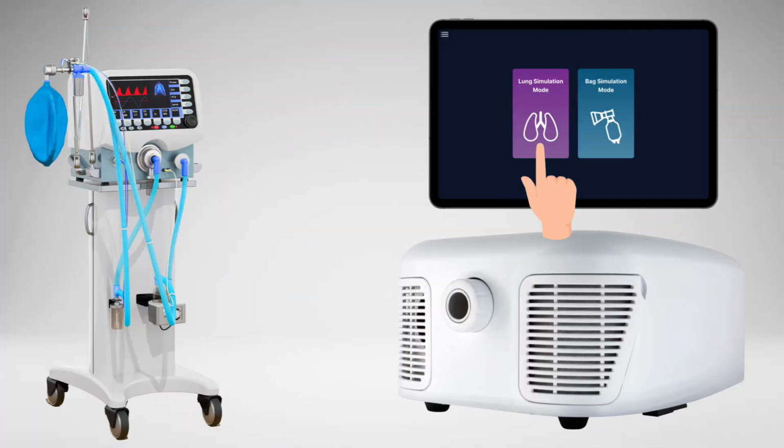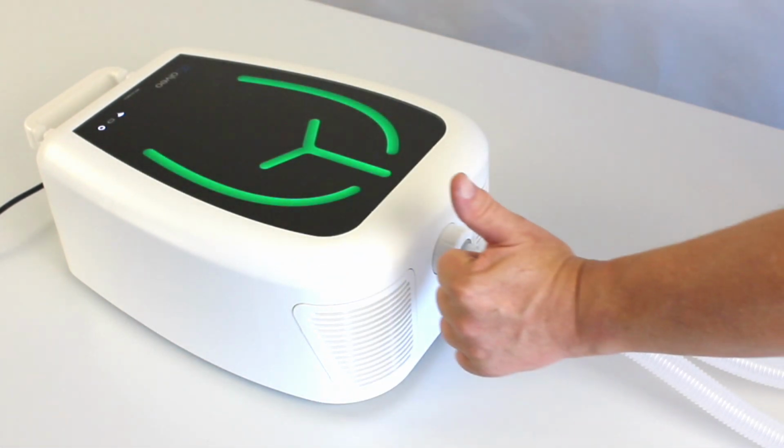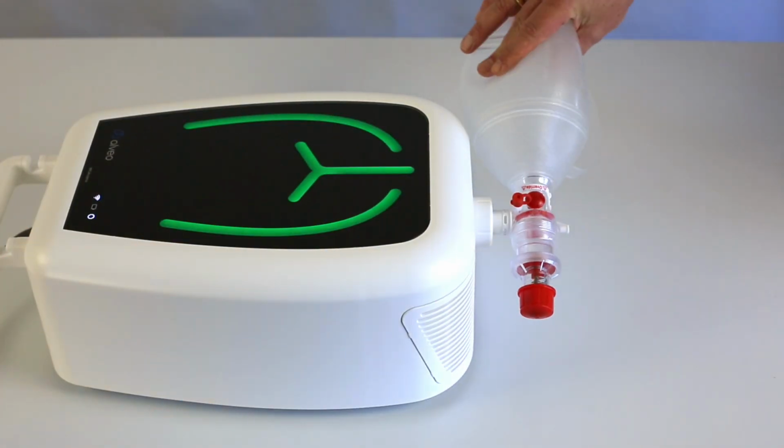To use alveo with a ventilator or assisted ventilation device, connect the patient tubing to the patient port on alveo and select lung simulation mode on the educator tablet. To use alveo with a bag valve mask, connect the bag to the alveo port and select bag simulation mode on the educator tablet. Perform a few manual tests.